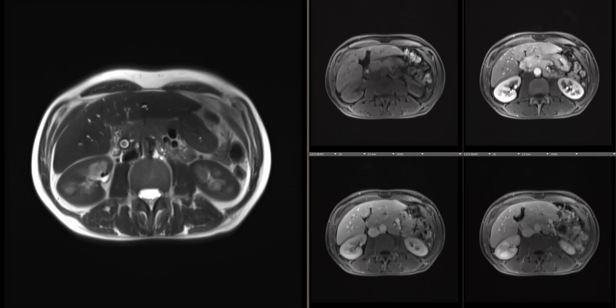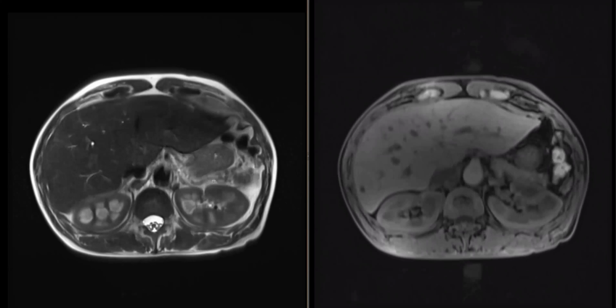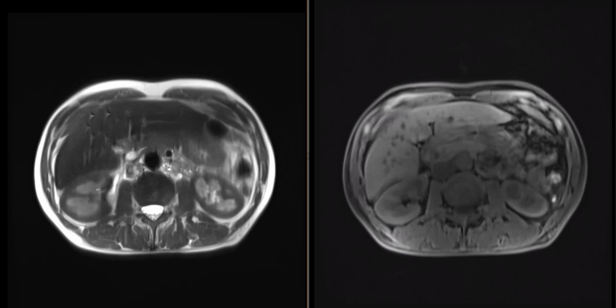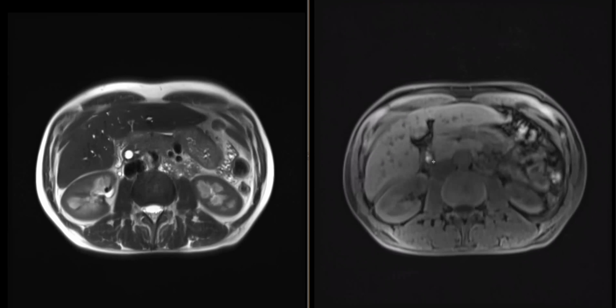And I'm going to come to the T1 pre-contrast. Sickle cell? Yeah. Oh, good job. Isn't that crazy? Shenoy-Bhangle got it too. In all of my training, where we've had a high sickle cell population, I've never seen so many manifestations in a patient. So we have the small calcified spleen, the renal cortical hemosiderosis, and pigmented gallstones. The constellation of findings is in keeping with sickle cell.